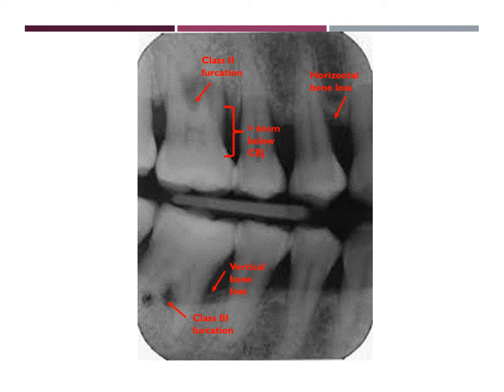In this bitewing, you can see the class 3 furcation on tooth number 30 as well as the class 2 furcation on tooth number 3. On that same tooth, you can see bone loss greater than 6 mm below the CEJ. There is horizontal bone loss on the anterior maxillary arch, and vertical bone loss closer to the posteriors of the mandibular arch.